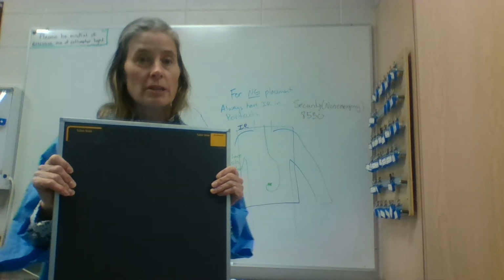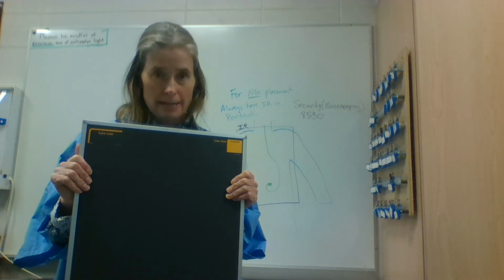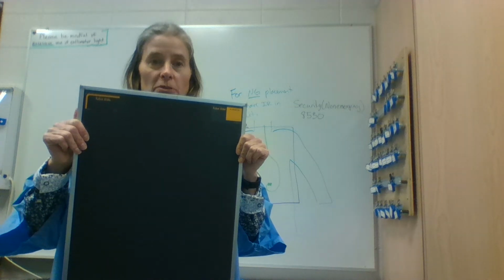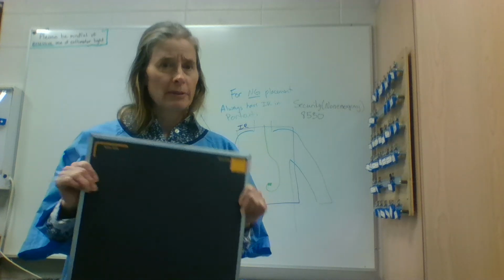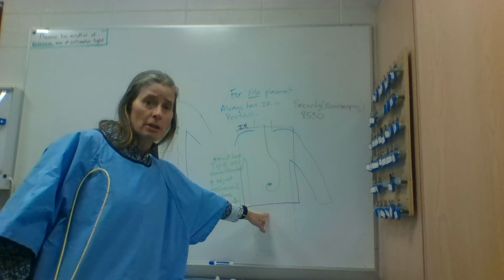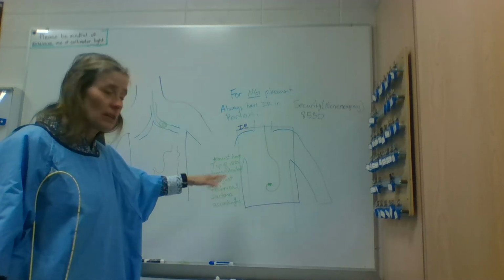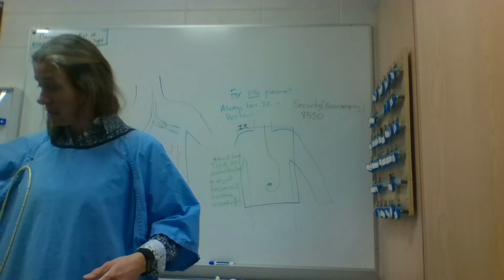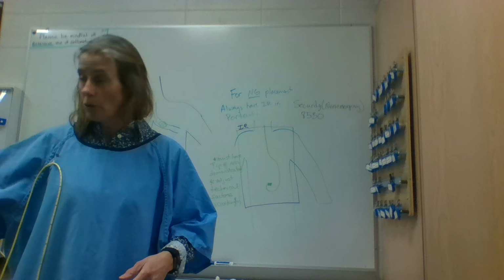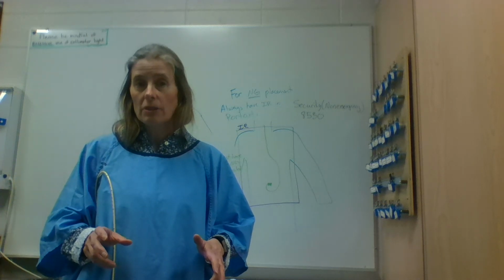We also need to ask ourselves, based on the typical location of the stomach, are we going to have the image receptor up above the shoulders, or is it maybe going to have to go down a little bit lower? Well, it's going to have to go down a little bit lower to ensure that you include that tip. Also, if it's going down lower into the stomach, and we think about the different body habituses, there are some body habituses that we need to make more technical factor adjustments to.